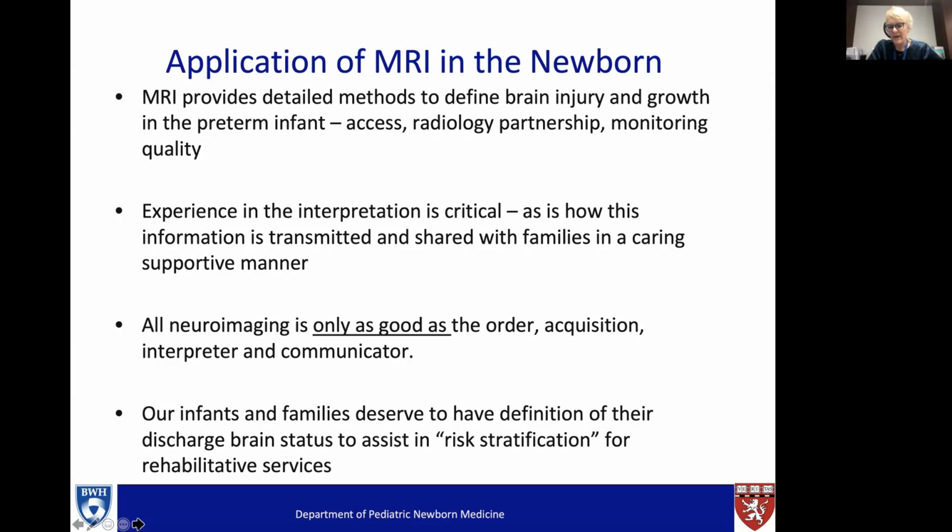Our infants and families deserve to have definition of their discharge brain status to assist in risk stratification for very limited rehabilitation services, so you can apply the right services to the highest risk infants for the right reasons.